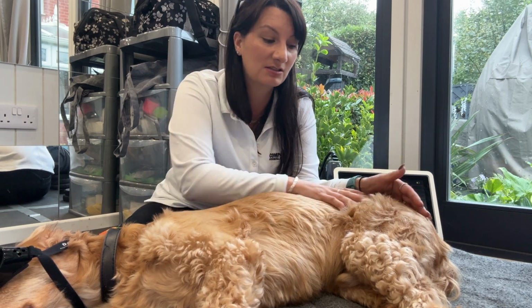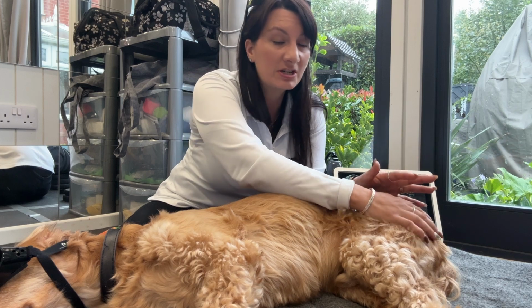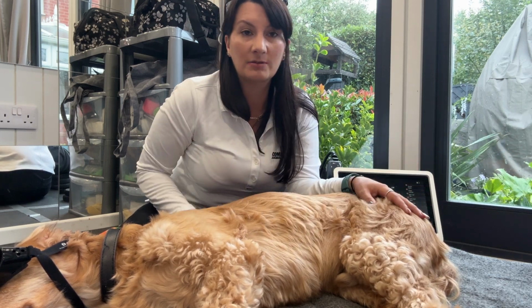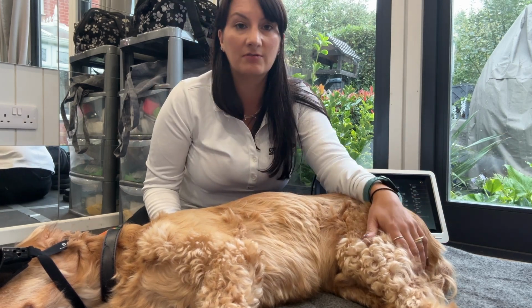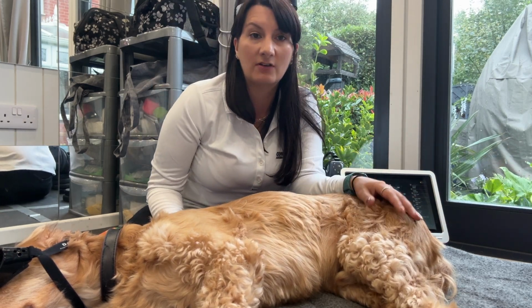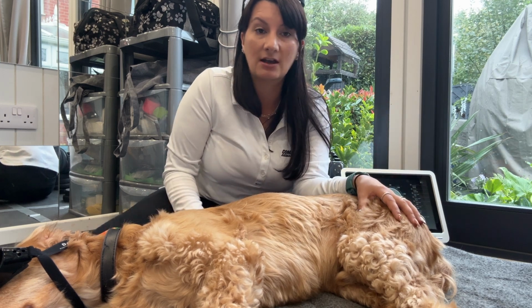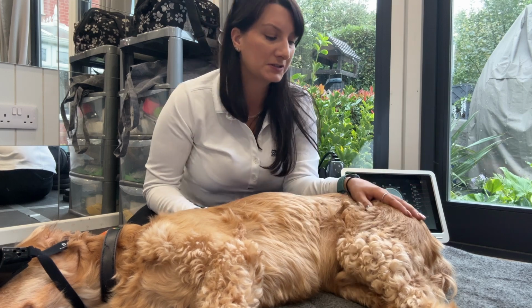Compensation is a big thing. So we should never just be treating a small area. We should be saturating as much tissue as possible. Now, I know that often comes down to a time thing, and that's why we need to be really understanding of our devices, and really figure out how to get the best out of our device based on the patient that's in front of us.